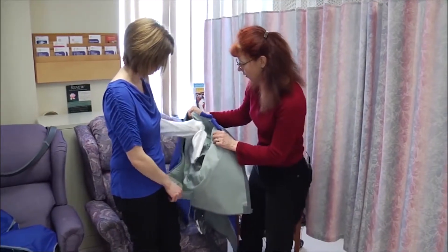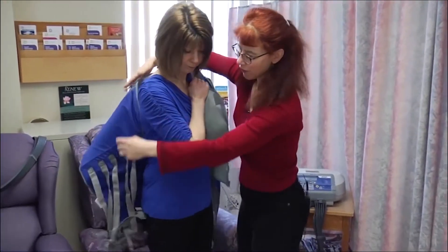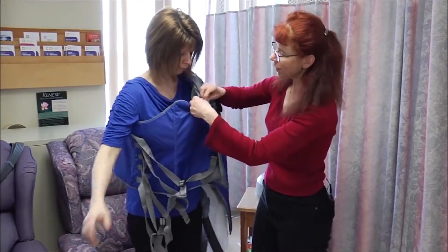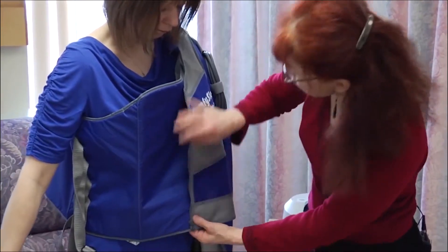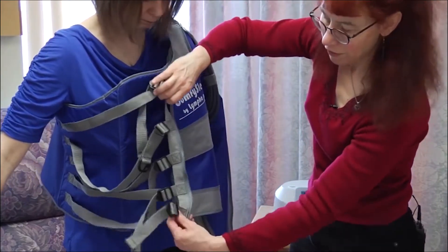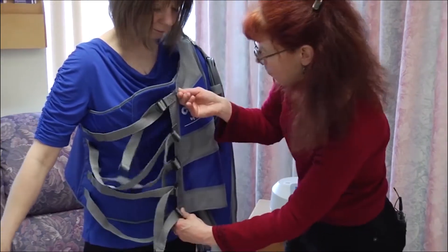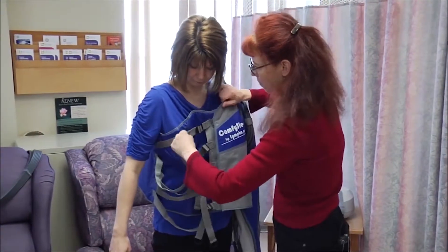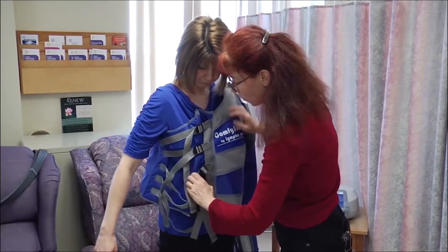She's going to place her arm inside, and then this will come around the side of her body. There's a piece of Velcro right here that helps to hold it. If you affix both of these Velcro closures, you can take the strap where the zipper is and go ahead and pull the zipper up. At that point, you can pull the straps to tighten them — you want it to be snug but not overly tight.